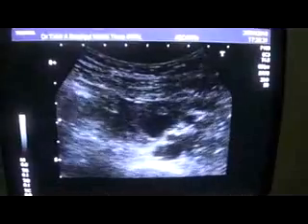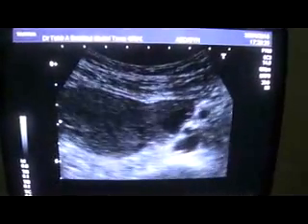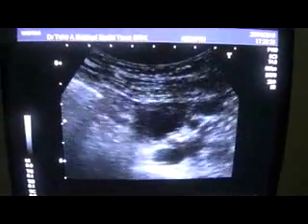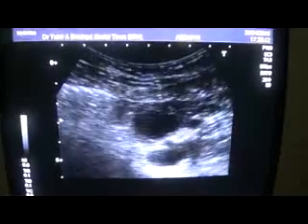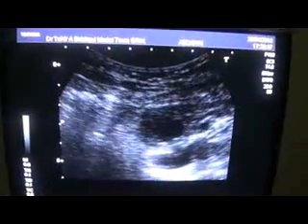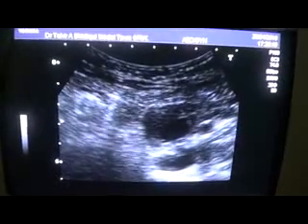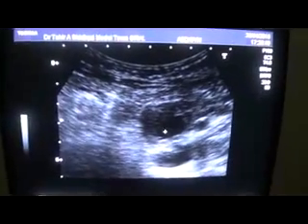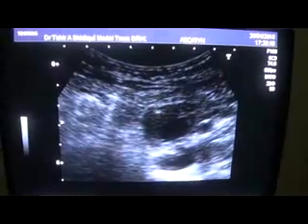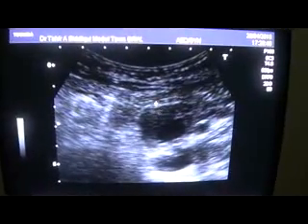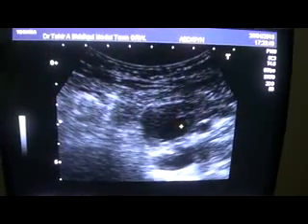Here is the main area of insult — no fetal bones, no yolk sac, nothing is seen. This is our case of the day: a case of ruptured ectopic pregnancy confirmed by positive pregnancy test. This is a bleed concealing the flow of fluid, as we also saw fluid in the hepatorenal angle and Morrison's pouch, meaning the fluid is traversing upwards and there is leakage.